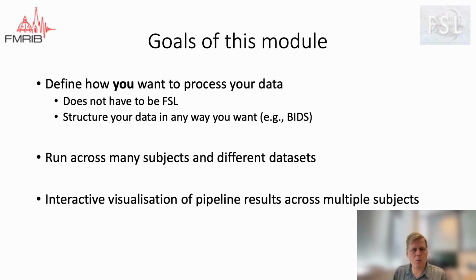So ideally, we would like to easily write our own pipeline, which processes the data in the way that is ideal for our data set, where we correctly deal with the peculiarities of our data. And we don't necessarily want to be limited to FSL. We want to use multiple neuroimaging tools.